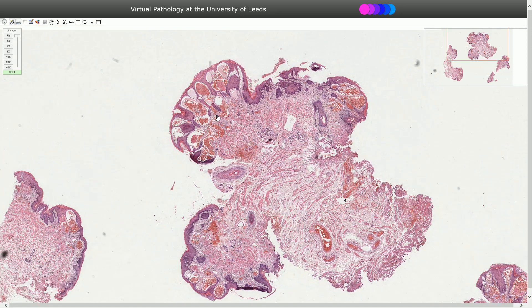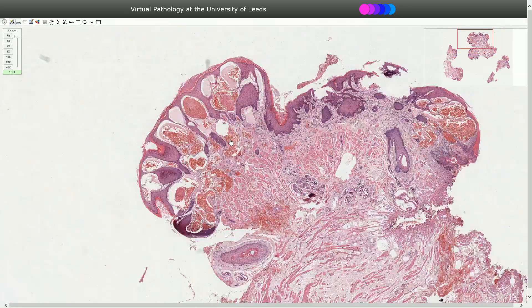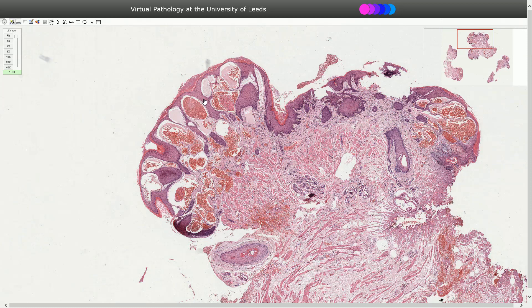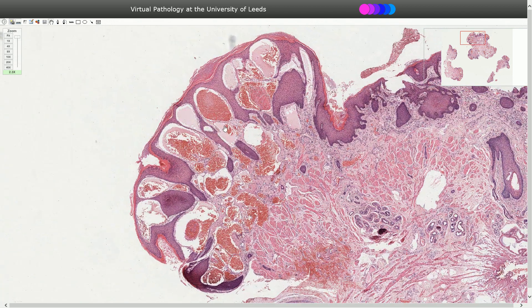This is the skin of the scrotum, and on higher magnification we can see marked ectasia of papillary dermal blood vessels. Quite typical for angiokeratoma is that these blood vessels herniate into the epidermis, resulting in the appearance of intraepidermal blood vessels.